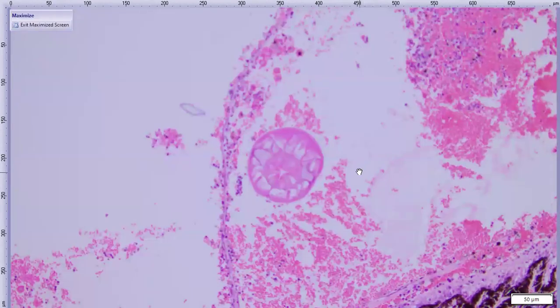In this particular cross-section. So in the end, I just said, yeah, there's a nematode parasite here, definitely do a fecal, do empiric deworming. There are reports of Dirofilaria, usually the L4, L5 larva, migrating through the eye aberrantly, so definitely check heartworm status in this dog too. The features of this do fit heartworm, however, they're not by any means specific to it, so it could be something else as well. And it's so atypical because it's an adult worm.